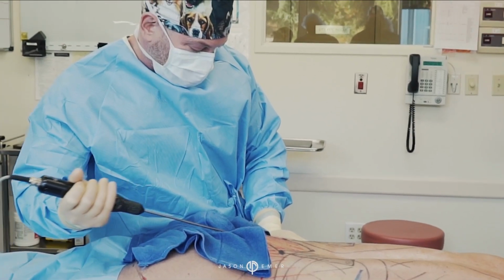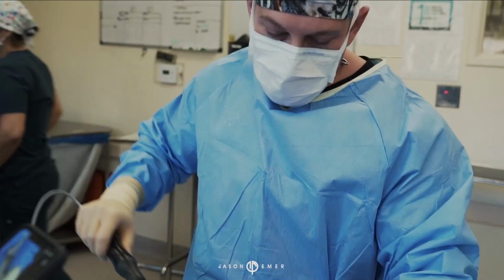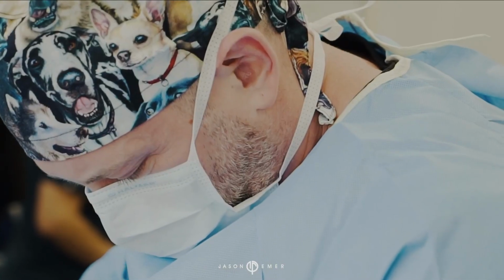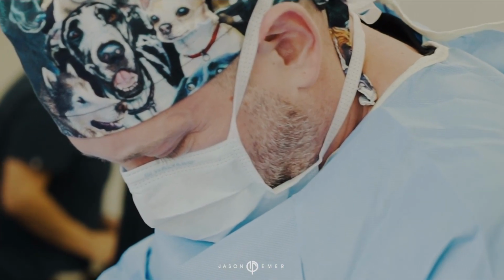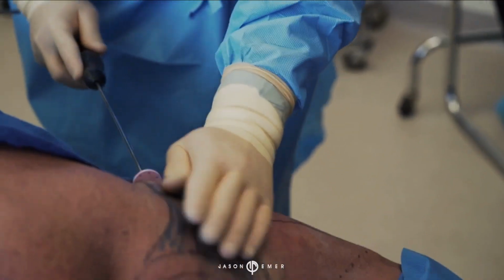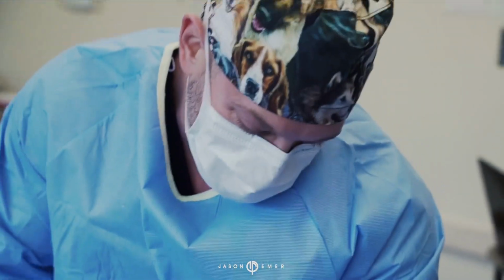So now we're using the Vaser device. He's very thin, and a lot of guys that are thin don't have a lot of deep fat. They have superficial fat, and that can cause irregularities if you don't use the Vaser. So now we're doing Vaser on the arm, and this is an area a lot of doctors don't do, especially the shoulder, because it's more dangerous.